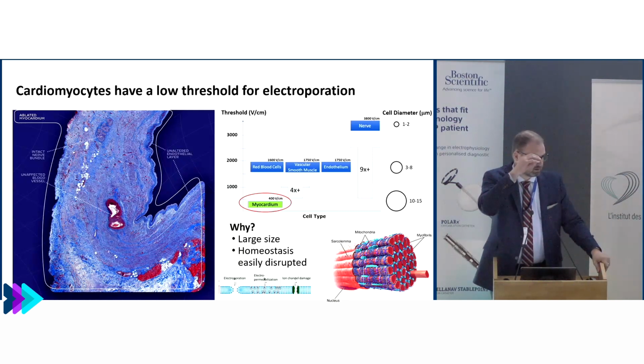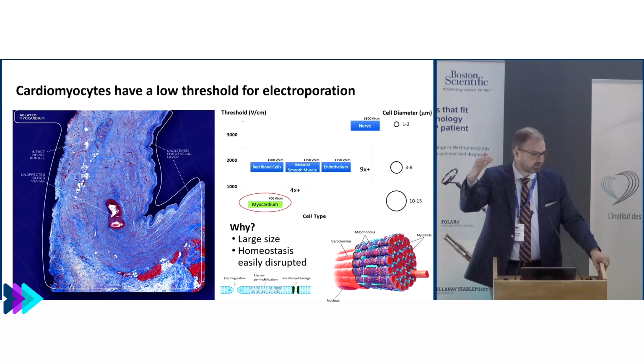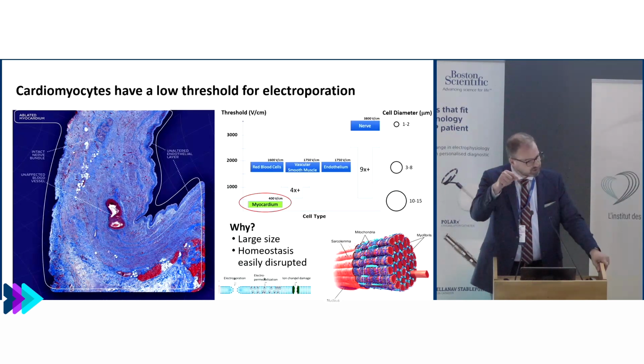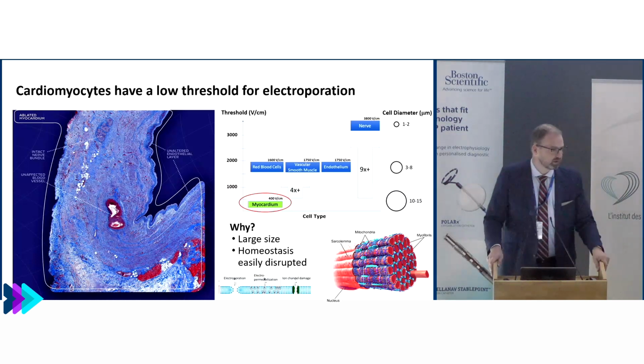If I'm not misunderstanding, the ratio between this and the axons, for example, is true? It's broadly speaking true. It's multiples higher for an axon. And then, of course, you can talk about, well, what are you talking about? A myelinated axon? Are you talking about the distal ends of the axon, the GPs? Yeah, I mean, we can get into all those things. But since that is a smaller cross section, it's harder to electroporate.